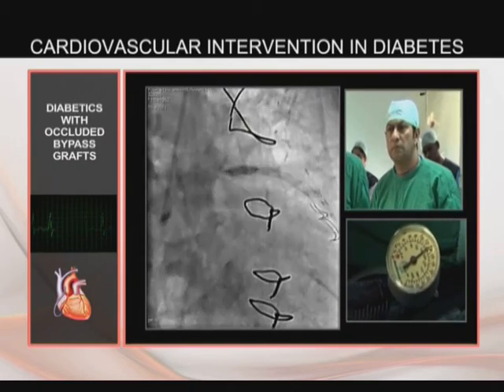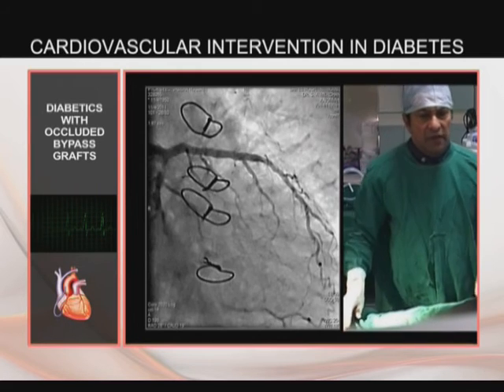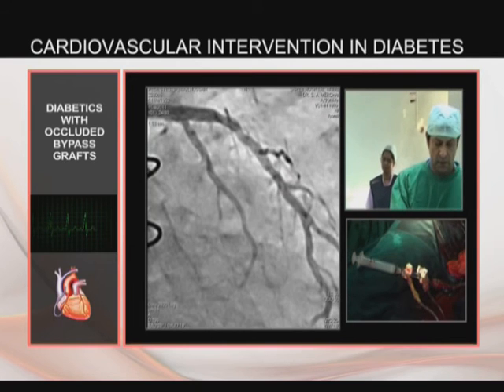Post dilatation, you can see the excellent final result. Though the nature of the disease is a more diffusely diseased vessel because of the long-standing uncontrolled diabetes in a post coronary artery bypass patient with occluded grafts.